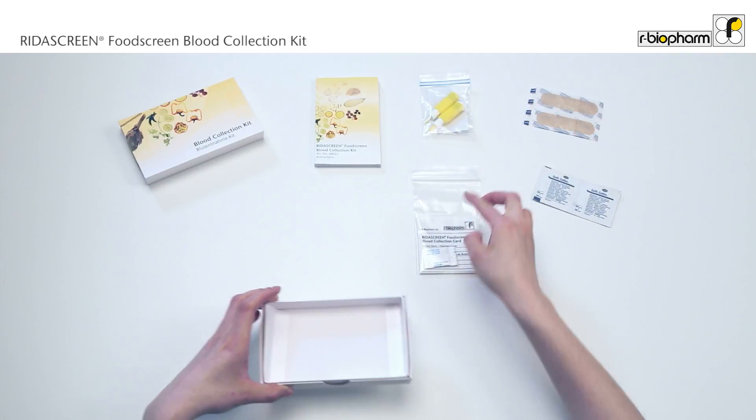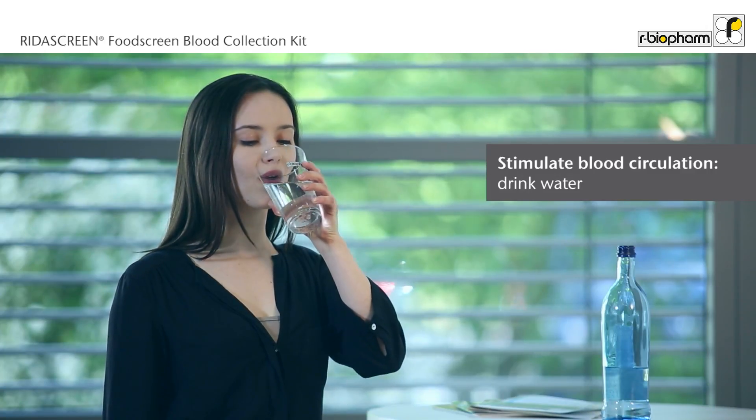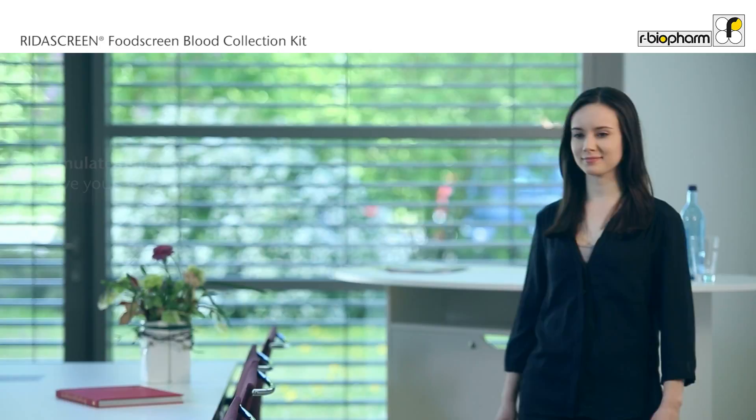Blood collection card. To ensure a good blood flow, drink plenty of water before the blood collection and choose a warm room for blood collection.